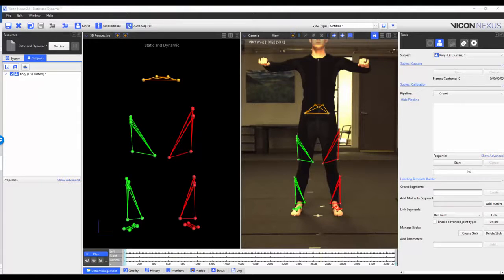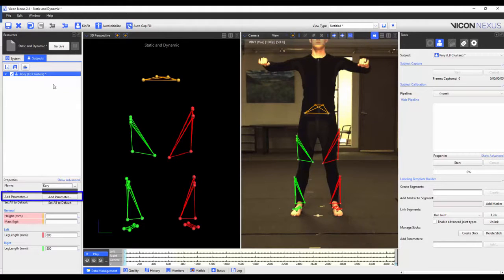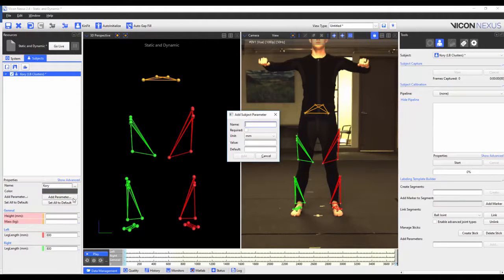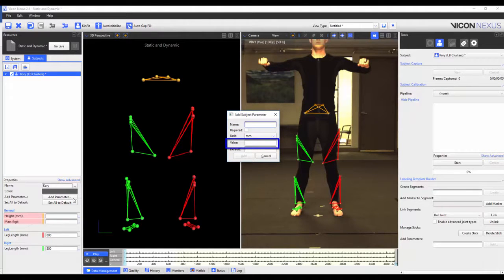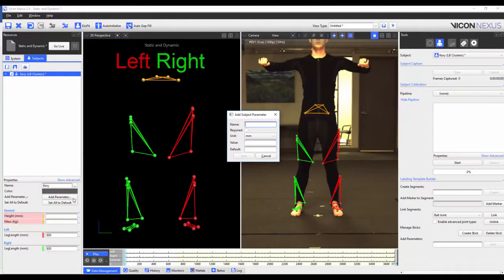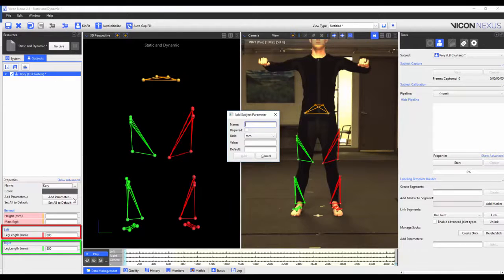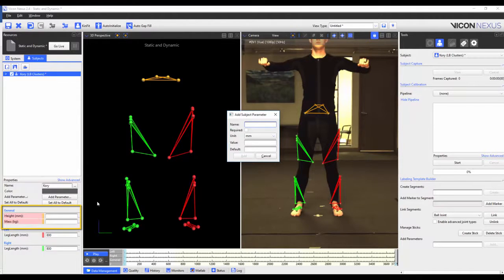Another feature includes the ability to add subject parameters. These aren't necessary for your labeling template, but can be stored in the VSK file and these parameters can be referenced later if needed to perform modeling calculations. To add a subject parameter, we highlight the subject's name and then press the add parameter button. This will open a new dialog box where we can enter a parameter name, set the parameter to required, change the unit, and enter a pre-existing value or assign a default value. When you enter a name, if you write the parameter with the word left or right all as one word, it will appear under the left or right heading in the properties list. If you don't have a left or right context, it will appear under the general heading.